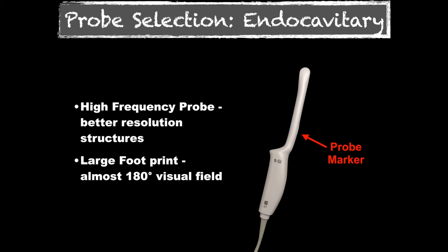We're going to pick an endocavitary probe. This is a high-frequency probe, which means that we're going to see structures really well, but we're not going to see very deep into the pelvis. Fortunately, it has a large viewing window even though it looks like it has a small footprint at the top. That's wrapped around the tip of the probe and allows us to see about 180 degrees, which is great for looking in the pelvis.